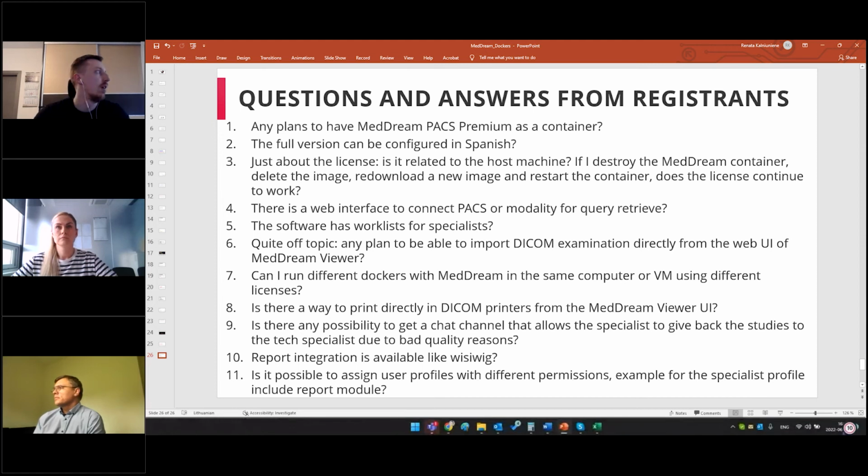Of course, unless there is a two major release difference. So some parameters, properties might already have changed, but if it's a minor change, most probably it will work. So for backing up the configuration file and the license file, the best is to mount them. So you would have them in Docker and in your host environment. And also you can copy paste them somewhere else even.